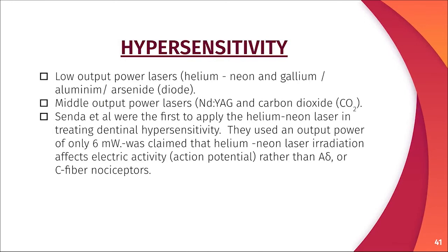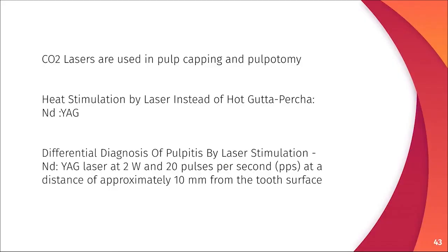Then in hypersensitivity we use low output power lasers, helium neon and gallium aluminum arsenide like diode crystals. Then middle output power lasers, neodymium YAG lasers, carbon dioxide lasers. In this figure you can see how a dentinal tubule gets closed up or gets sealed up after laser irradiation.